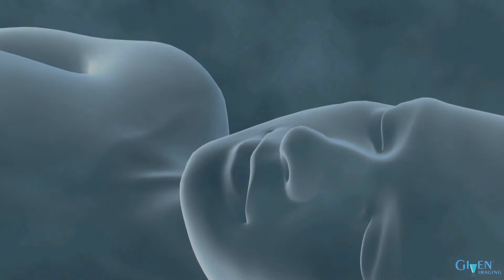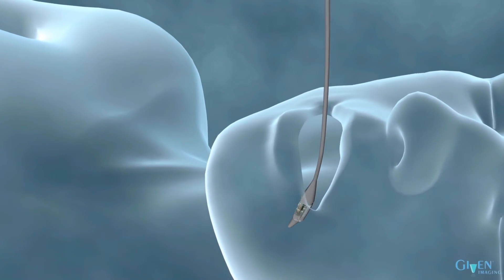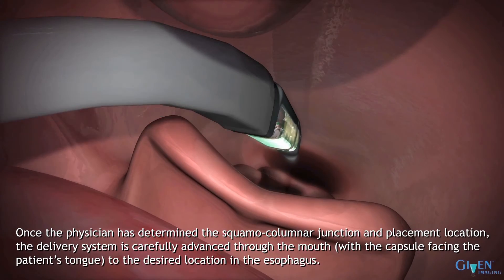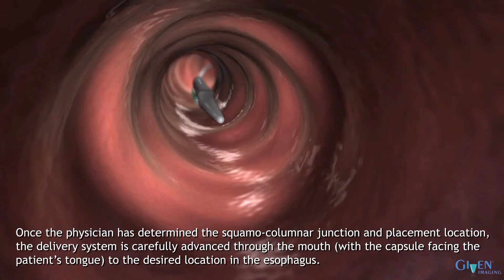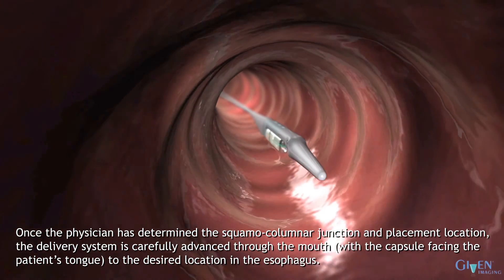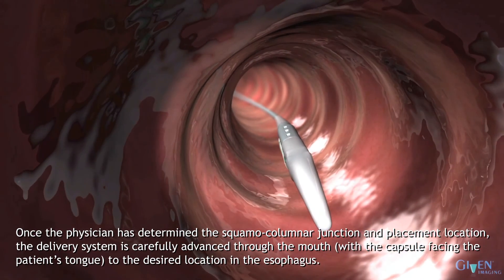The Bravo Placement Procedure is simple to learn and generally well tolerated by patients. Once the physician has determined the SCJ and placement location, the delivery system is carefully advanced through the mouth with the capsule facing the patient's tongue to the desired location in the esophagus.